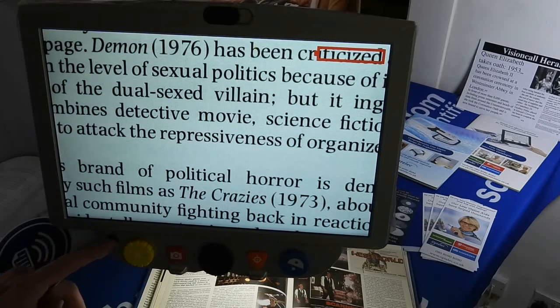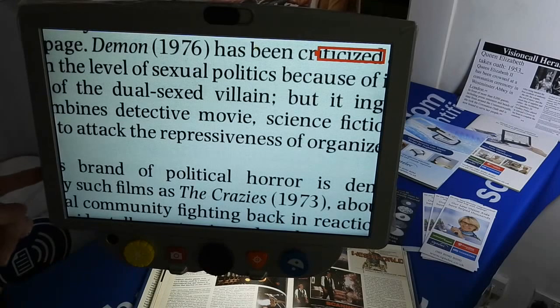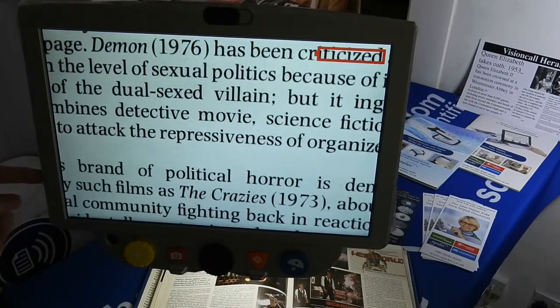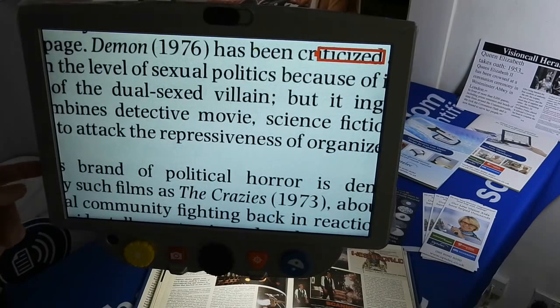On the side of the display there is USB support, and there is also an SD memory card slot. So you can save images to a memory card if need be.